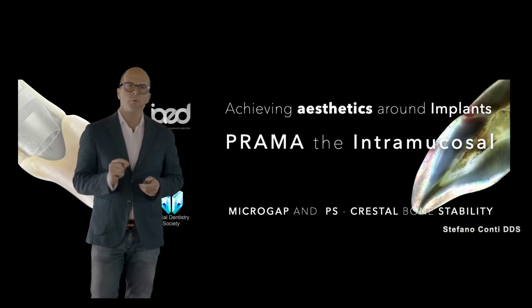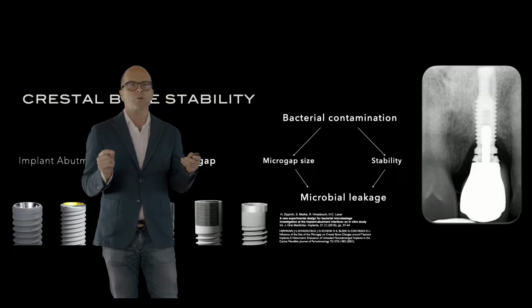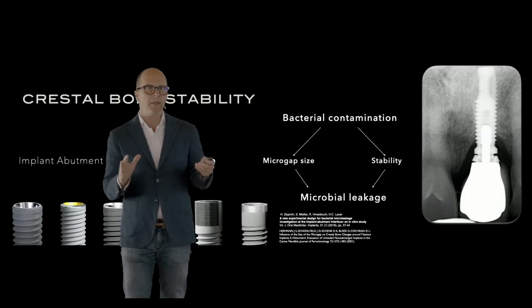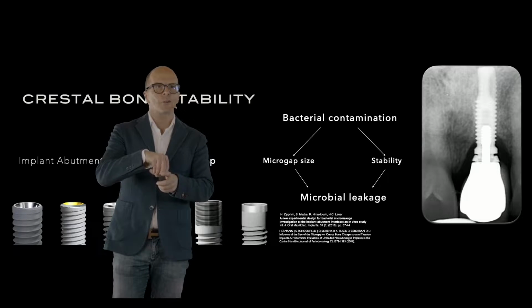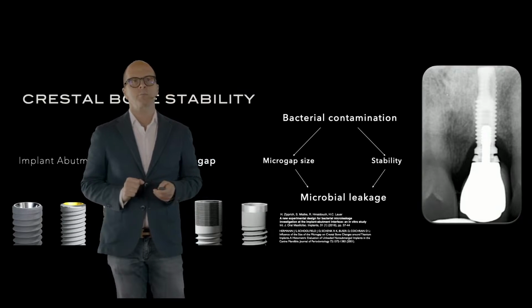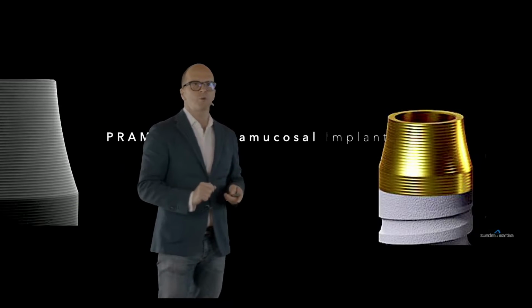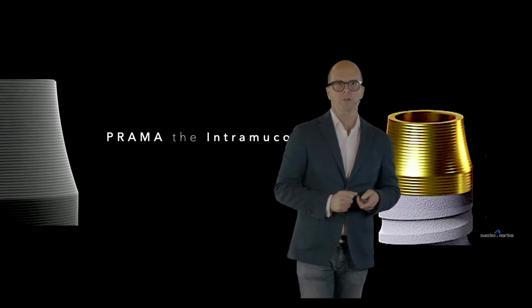When we think about the microgap, we should think that the microgap is going to affect the crestal bone stability. Depending on the size of the microgap and the stability of the implant abutment connection, we have microbial leakage, right? And it's going to affect the crestal bone stability. But now, I'm going to show you a new advanced concept of implant.